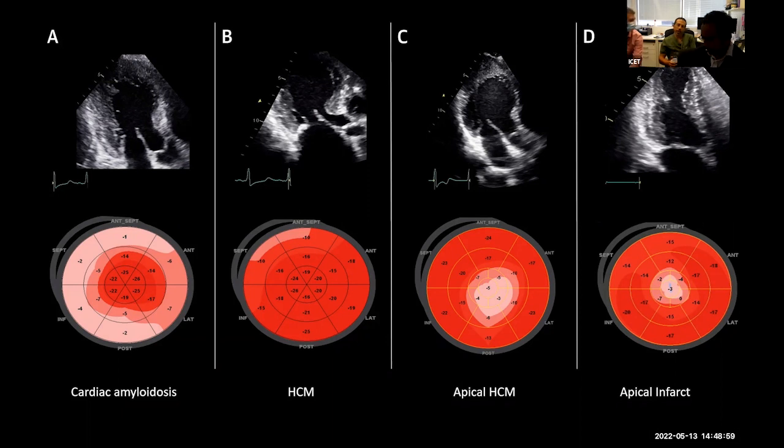Shanthosh, can I ask, and I acknowledge that we've got the guru here, Associate Professor Ord, sitting right next to me. Obviously you come from a cardiology background, and in the critically ill there's less strain work done, generally speaking. In the everyday in and out of the clinic cardiology department, does everyone get strain? Do you do this to every patient, or just to the chemo-oncology patients, or those with early stage diastolic dysfunction, or is it part of your default scanning for everyone now?